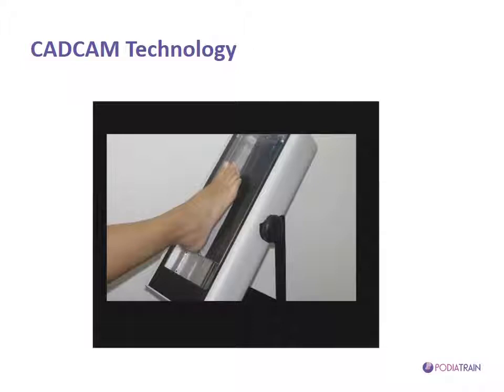Another technology that is used is known as structured light scanning, in which a projection of a design on the foot is captured by two different cameras, and the deformity of that capture will allow the imaging techniques to produce a 3D image.